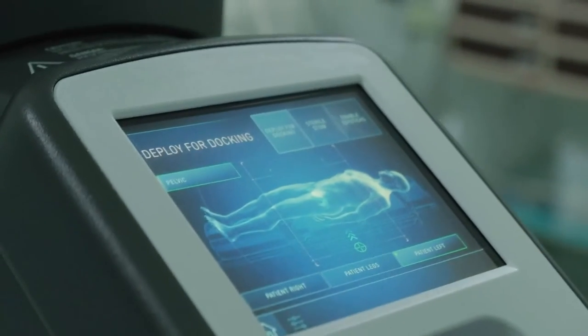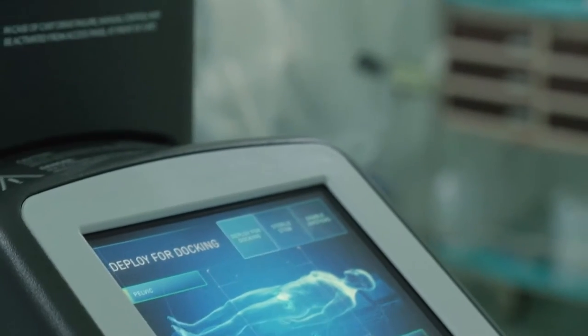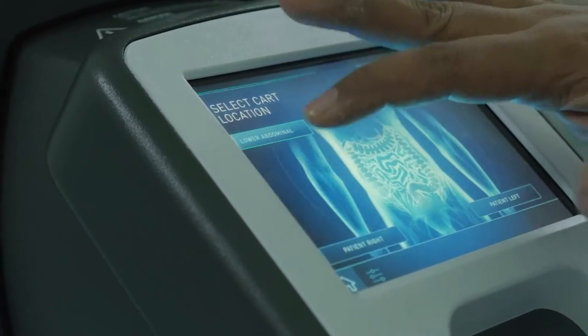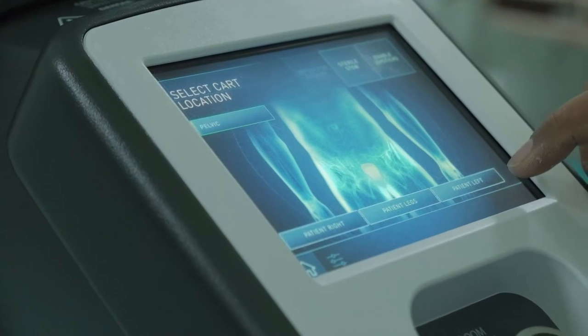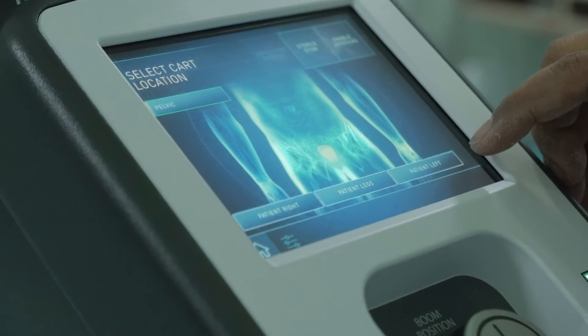So now we configure the patient cart for docking. We have already draped the cart, and now here we select the anatomy. So we can select lower abdominal, upper abdominal. We have a model here for pelvic surgery, so we select the pelvic. And then we select whether we are coming from the patient's left side or the right side.